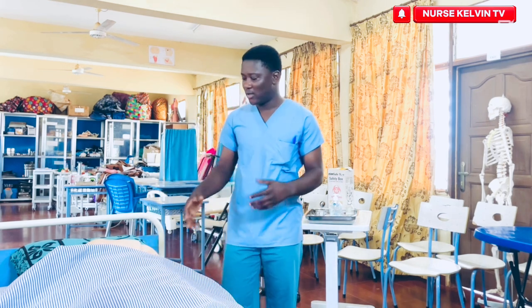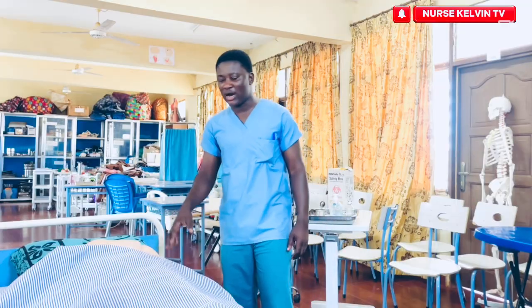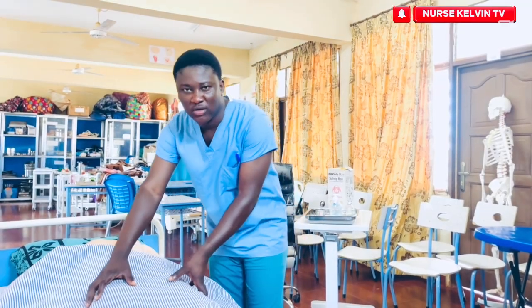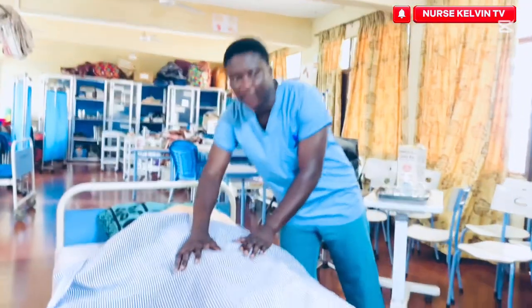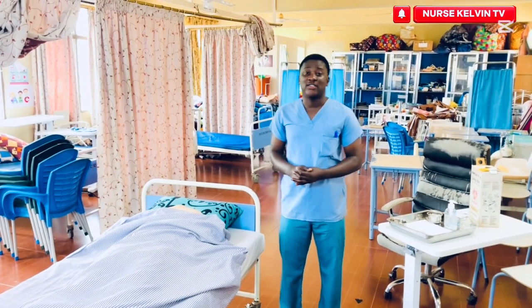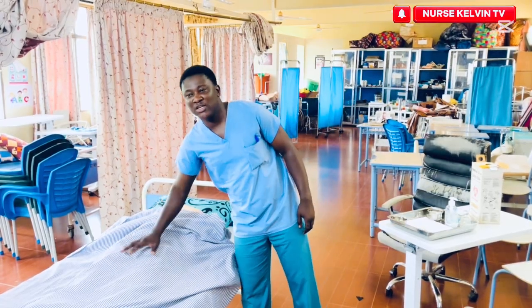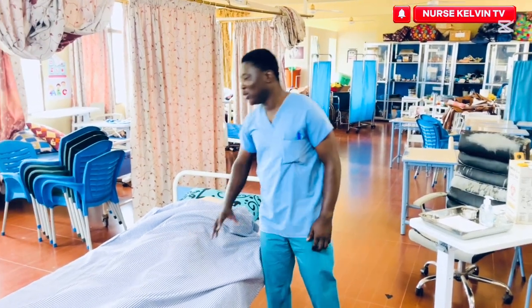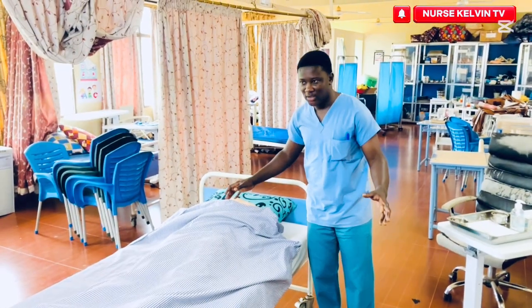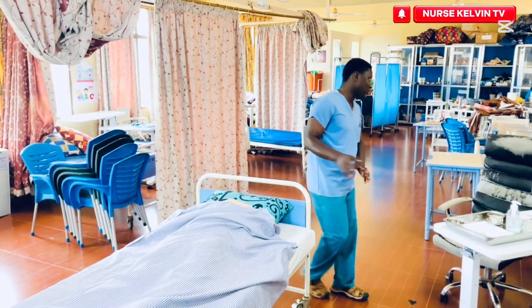So now we have already told Mr. Kwame that we are going to do this for the patient, on the butt area. So we need to make sure that we provide privacy. So guys, as I said, because we are going to use the patient, we need to provide privacy. Yeah, so we are going to provide privacy for the patient. That's one of the first things that you are supposed to do.